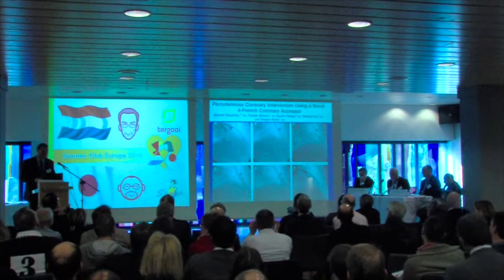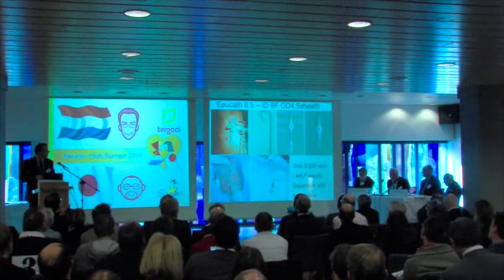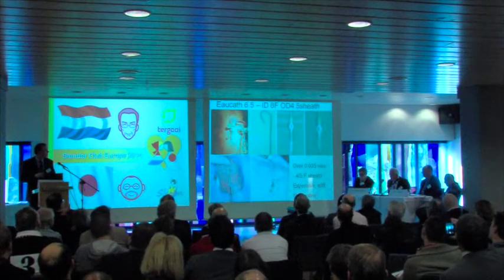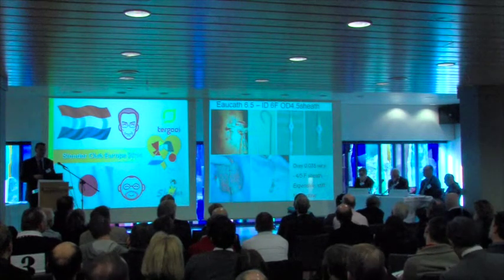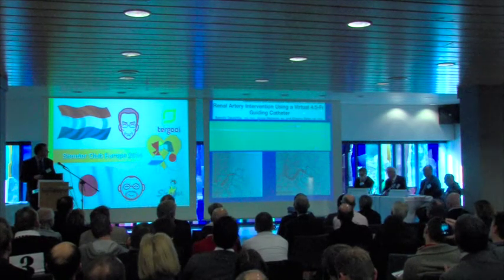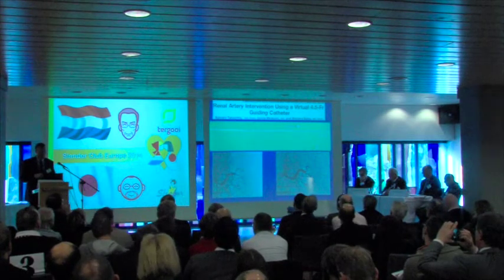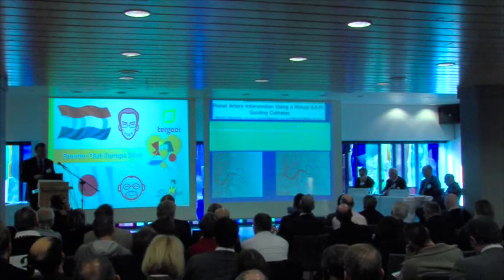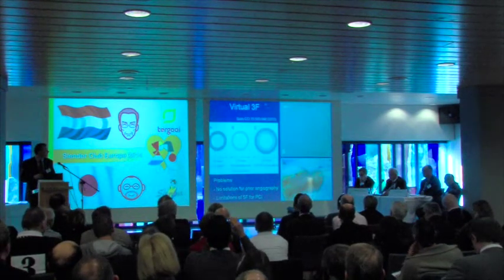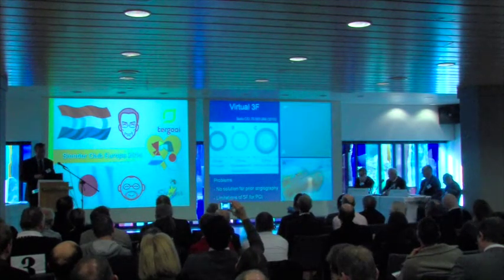So I'll just show some of the publications for these techniques. This is 4 French angioplasty. This is a sheathless angioplasty with a 6.5 French, which is equivalent to a 4.5 French sheath. This is a different sheathless system from Medikit, so they have a 6.5 French, which has a larger inner lumen than the Asahi system. And then there's the Medikit 5 French system, which is Virtual, which has the same outer diameter as a 3 French sheath.